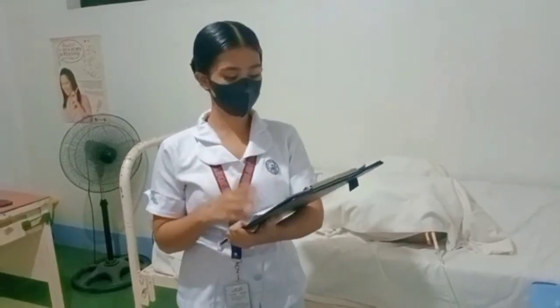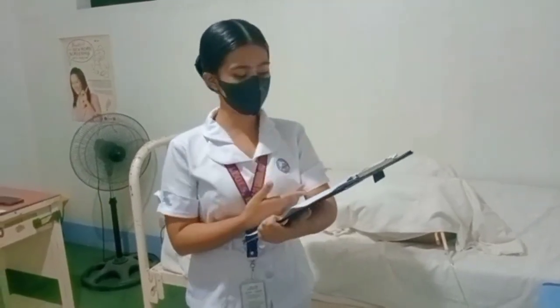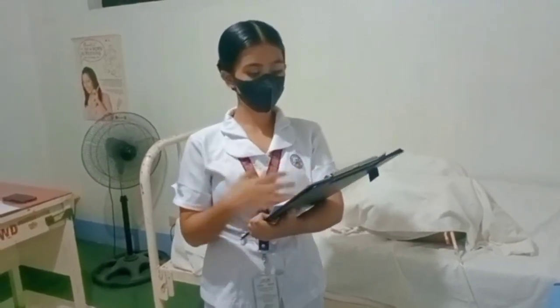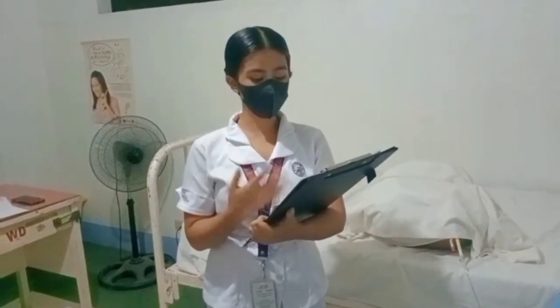The indwelling catheter must be drained properly and it must be inserted without discomfort. And the client must be comfortable. And for the documentation, I must document the date and time, the type and the size of the catheter, whether a specimen was obtained, the amount of urine, the description of urine, and the client response to the procedure.